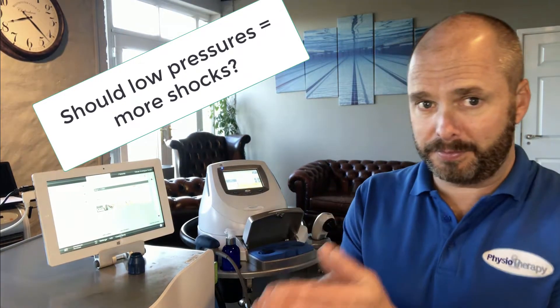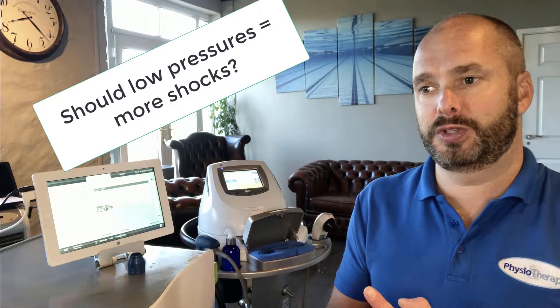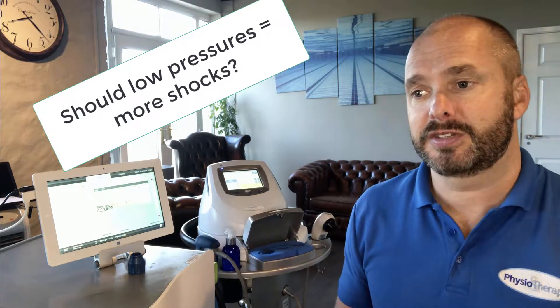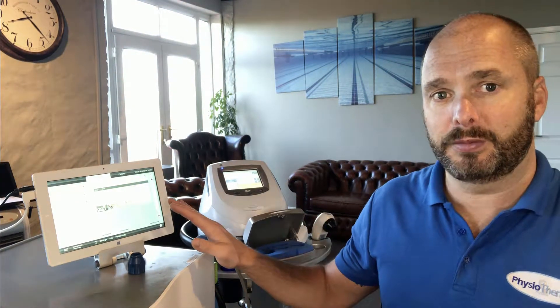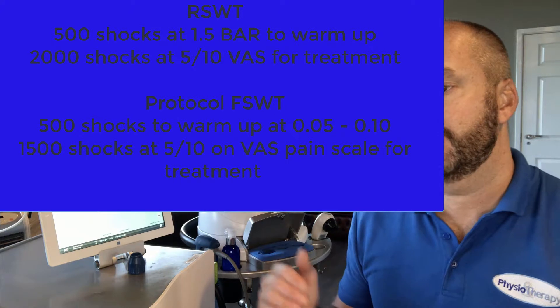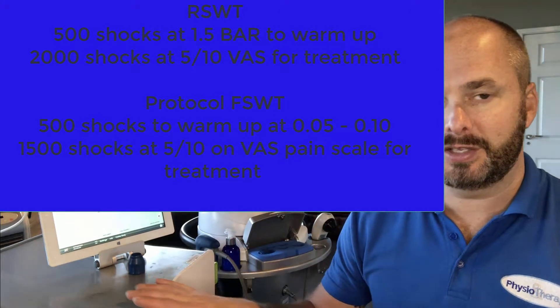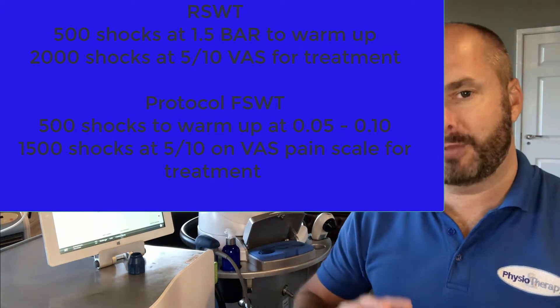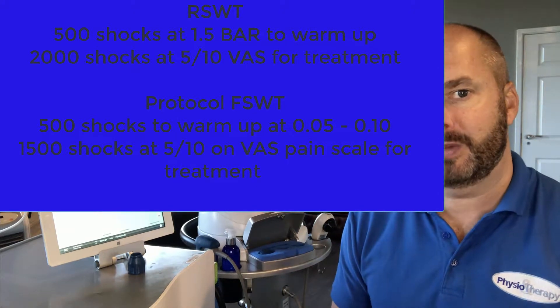The general rule of thumb is 2,500 shocks per session, across 3 to 6 sessions. You start with 500 shocks at a very low energy flux density to warm up the tissues and allow some numbing. The therapeutic dose is then 2,000 shocks where you try to get the energy flux density — or bar pressure on the radial — as high as you can, within a framework of 5 out of 10 on the pain scale.